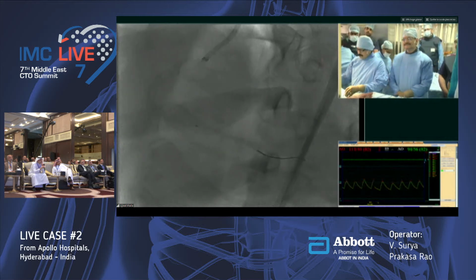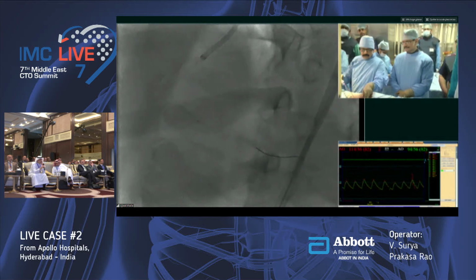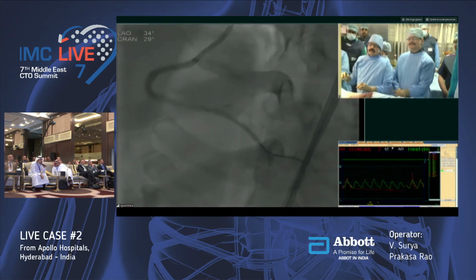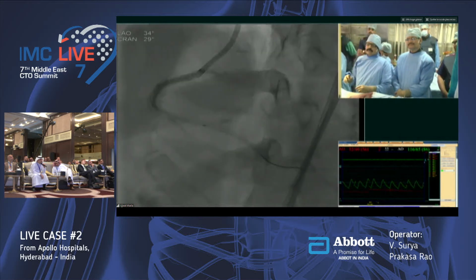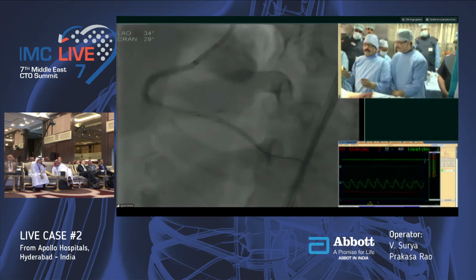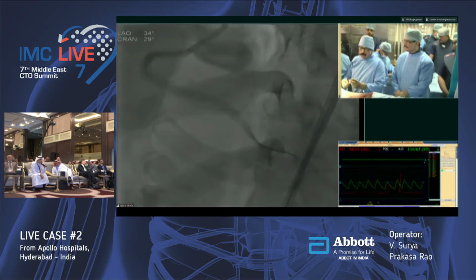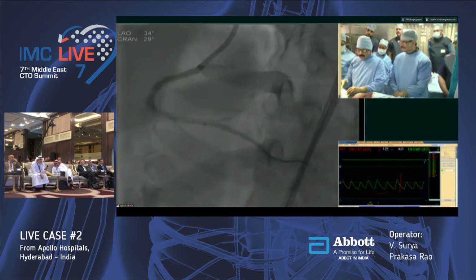Small bend area. This is anti-gravity. I'll give an injection, see. Yeah, okay. Now we can. Still a lot of ISR is there. Whisper also is a good wire. I will try even Whisper also. Give me Whisper.